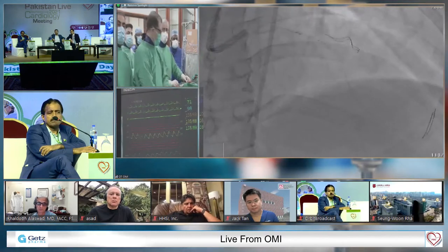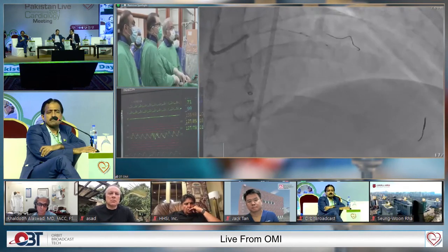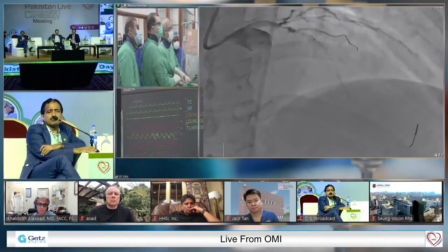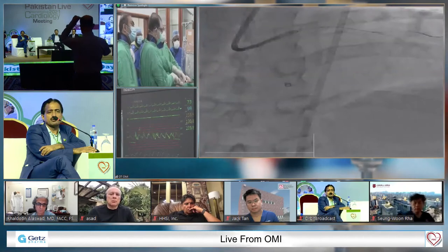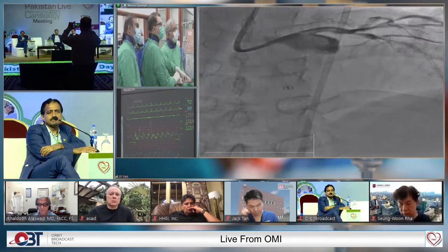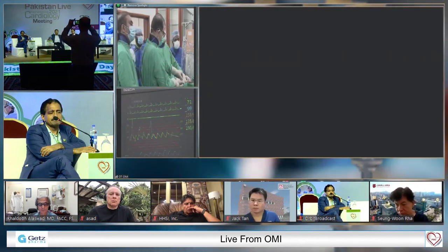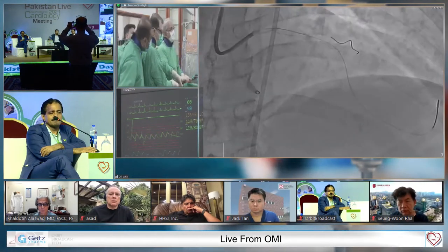You are with us right now. And now we're going to see what happens. Can you see through the little check, please? So, do you need to keep that right catheter in the RCA? Because once you have crossed and you're sure, I usually remove it. Yeah, I need to say a little more. What I'm going to do now, there's a big side branch.